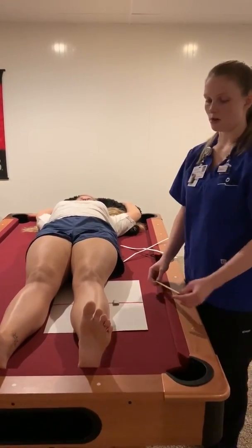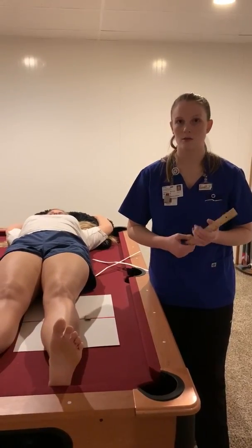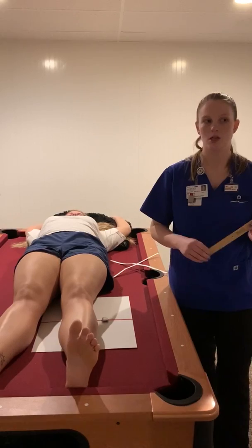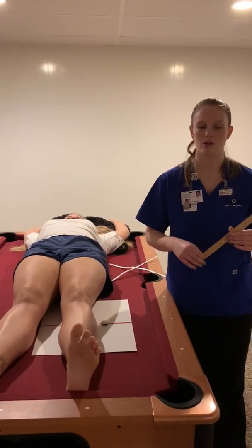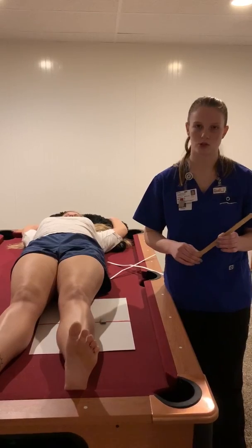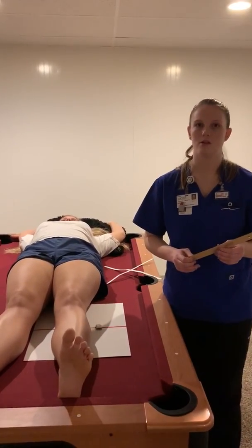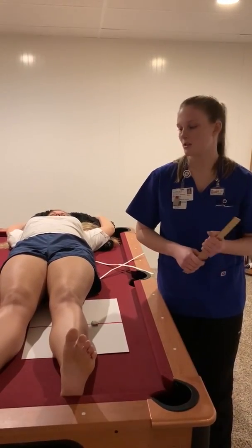And then I'd go outside of the room and shut the door and look up the 13 centimeters in the chart, and get the kVp and mAs that I would need for the exposure. Make sure that it's on table bucky and that there's a small focal spot. And then I would just tell her to hold still and take the exposure. There's no breathing instructions for the knee because it's on the leg. It's not near the lungs or anything, so you don't have to worry about breathing technique. And then I would tell her to relax and that she's all done.